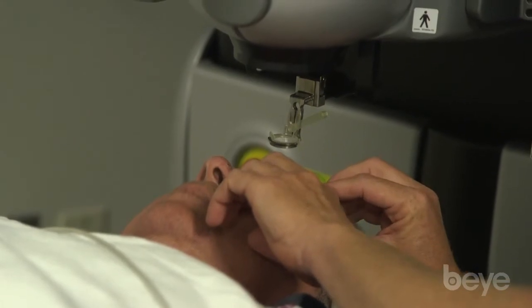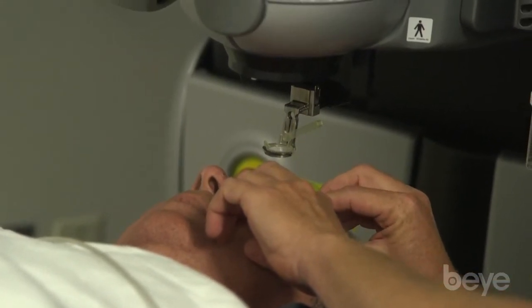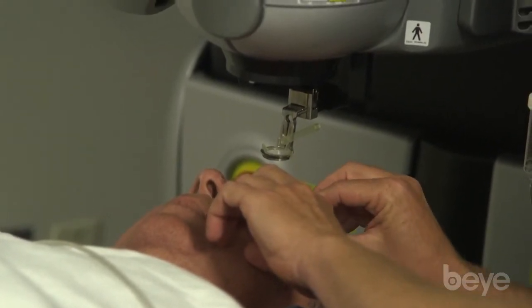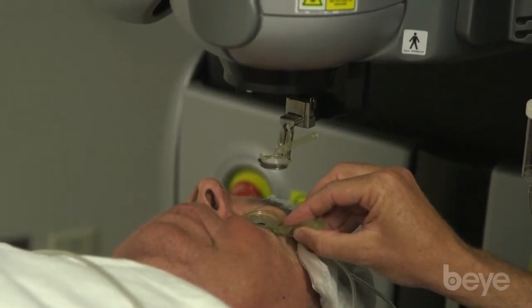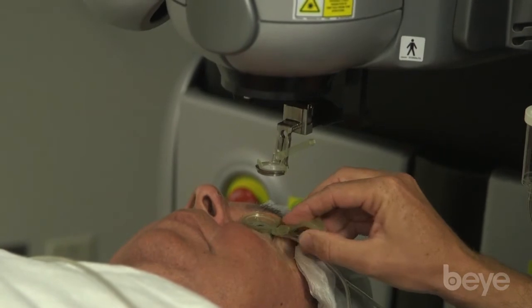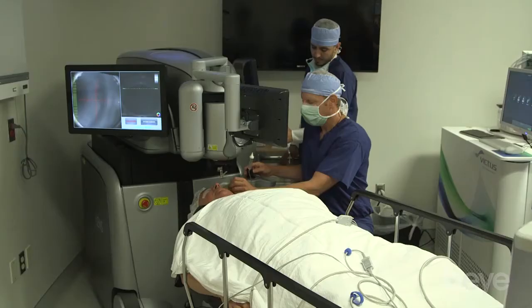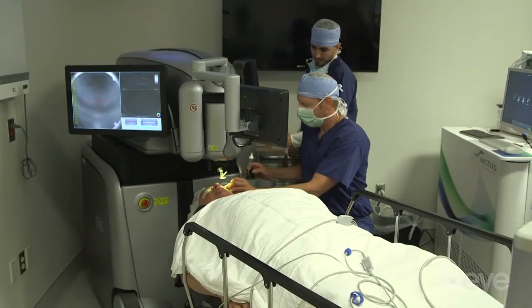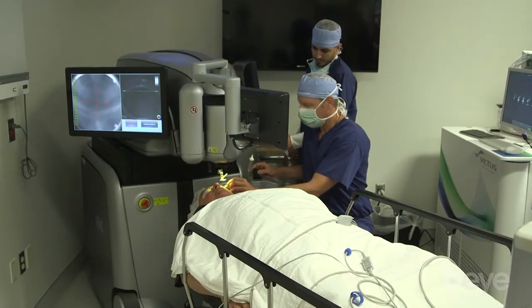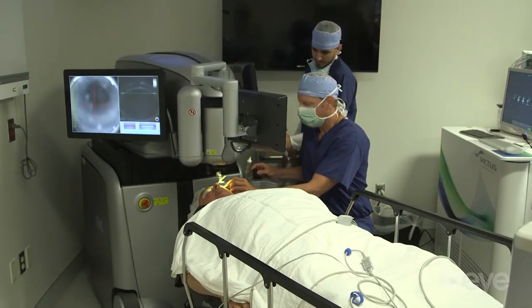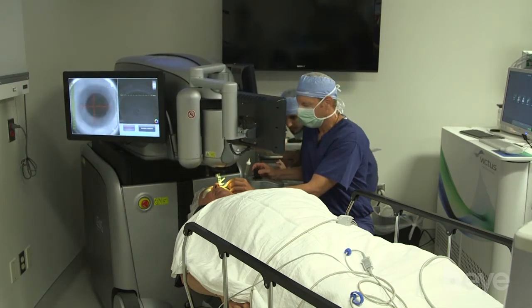You can see we're not going to use a speculum — just gently put this on. Vacuum on. Perfect. Hold as still as you can, partner. We're just going to use the joystick here to interface the two devices.